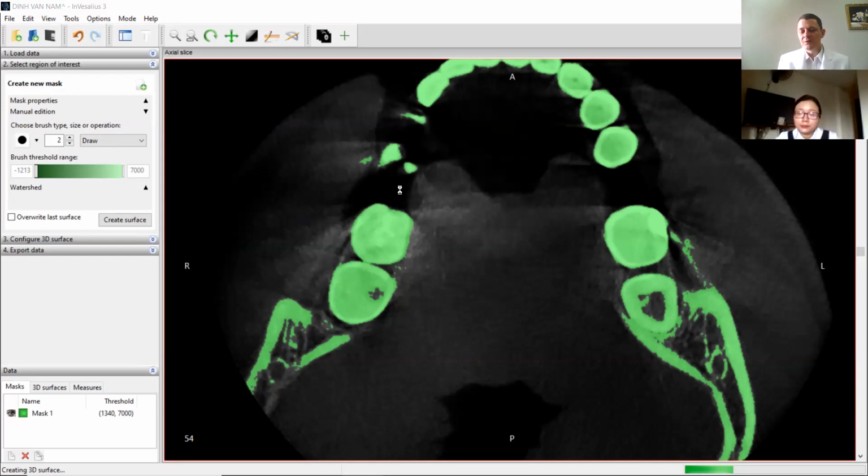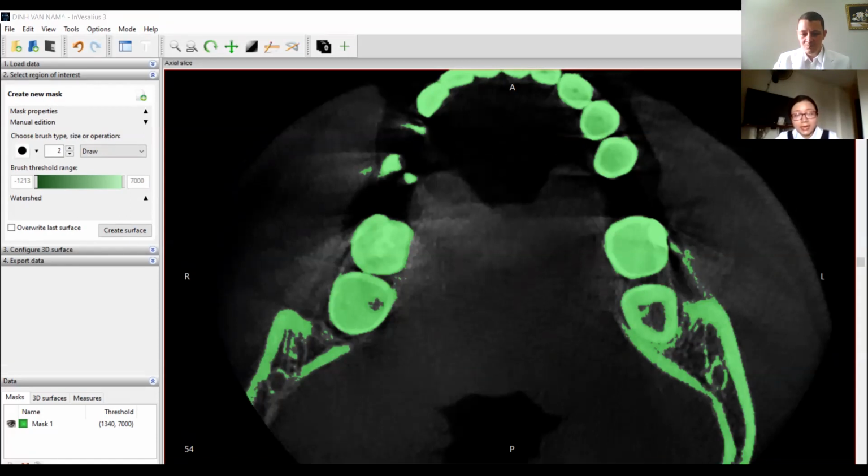You can have a plaster scanner for less than what the 3Shape intraoral scanner was costing, only the maintenance for 1 year. Thì mình có thể có cái máy scan mẫu hàm. Nếu cái máy scan ngoài miệng á, thì nó sẽ rẻ hơn cái máy scan trong miệng và preset rất là nhiều, và nó sẽ có cái bảo hành khoảng 1 năm.